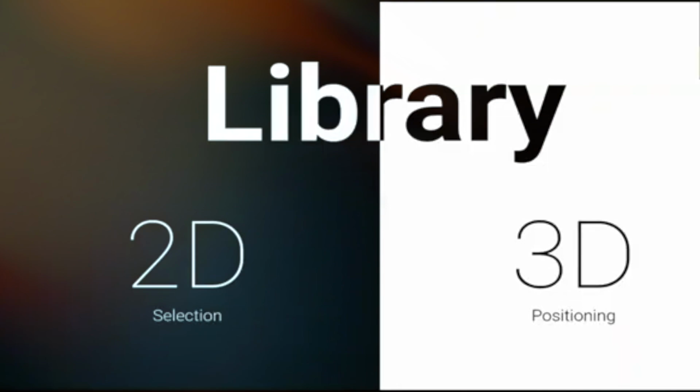Now, in terms of dental, if you think about it, libraries for me are at the center, at the core of digital dentistry, because if you think about prosthetics, we use libraries of teeth, which are predefined chunks of information that speed up the process. If you think about guided surgery, you need libraries of components, otherwise it would not be possible. Libraries of brackets for ortho, etc. So libraries at the core of it.